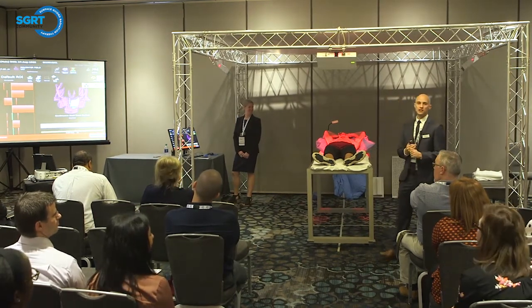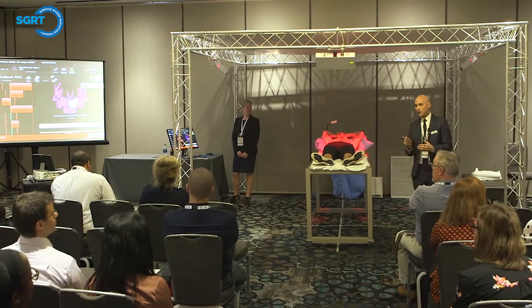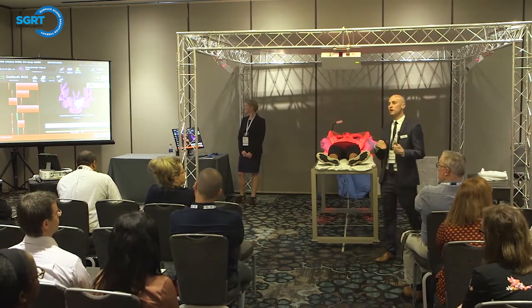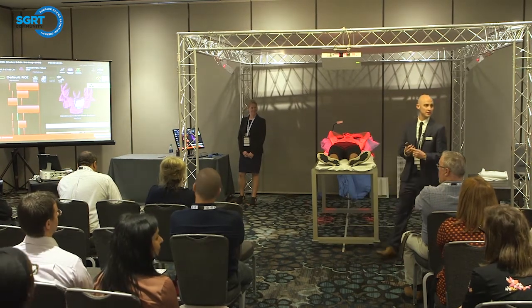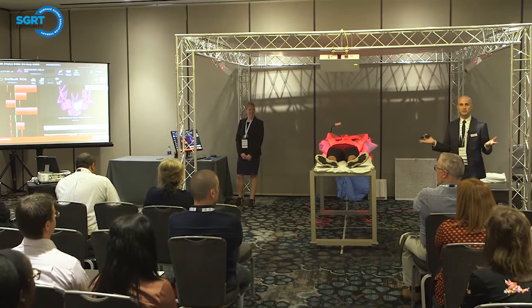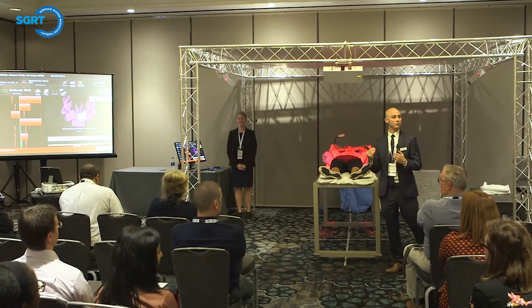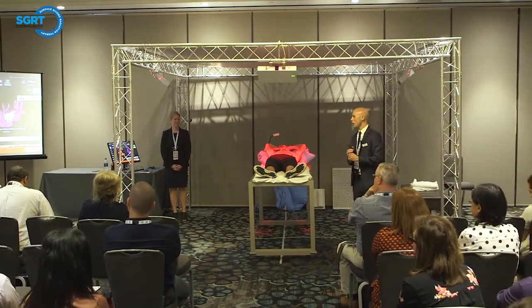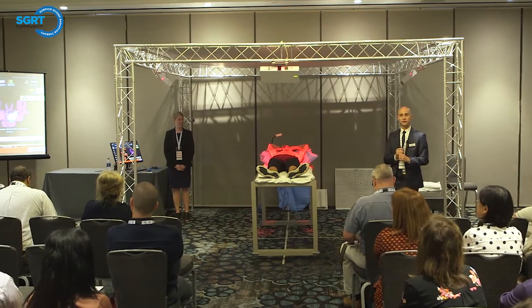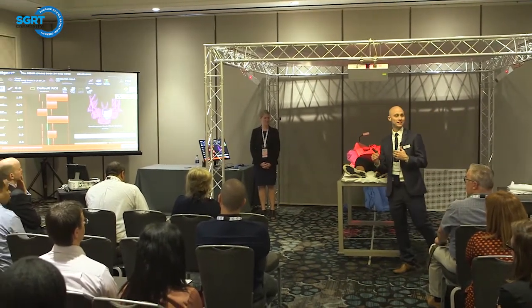And once we know that this is reproducible for the patient, we can step outside and continue along with our 5 steps. The next step would be E, the letter E, and that is everyday imaging. So if we have any imaging, we'll step outside, have him assume the breath hold position, and then take our ports. After we verify with our ports that everything is okay, we are going to move on to letter A, which is, you want to remember?